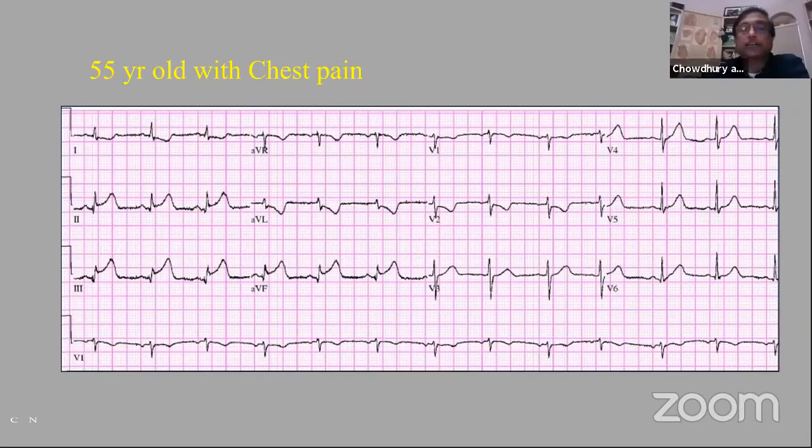...than the platelet activation. But we have to remember that this inferior ST elevation can be associated with, for example, ascending aortic dissection into the right coronary artery. In that case, the physical exam will be important, you know, the aortic regurgitation murmur. The patient may be in shock, in tamponade. So we need to keep our mind open: recognizing something, going for the obvious, but think about the differential and don't make a mistake.